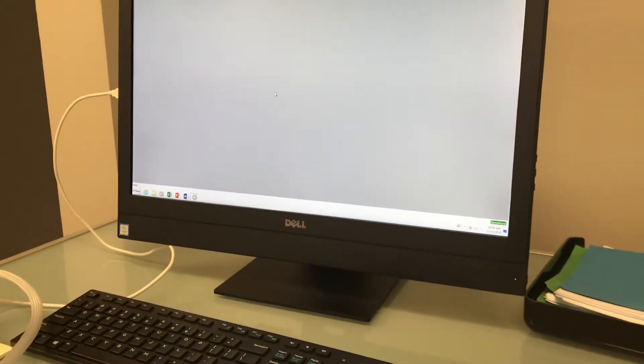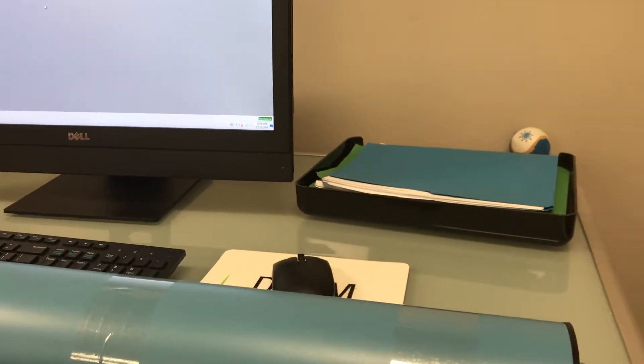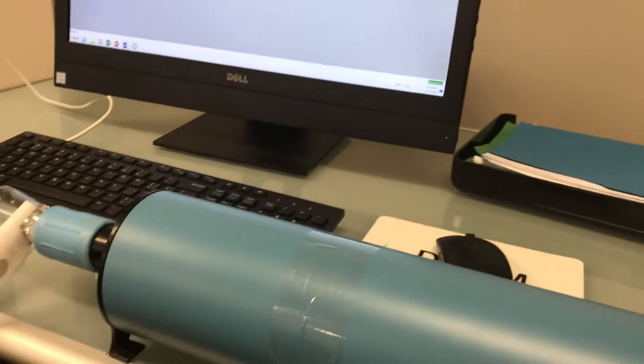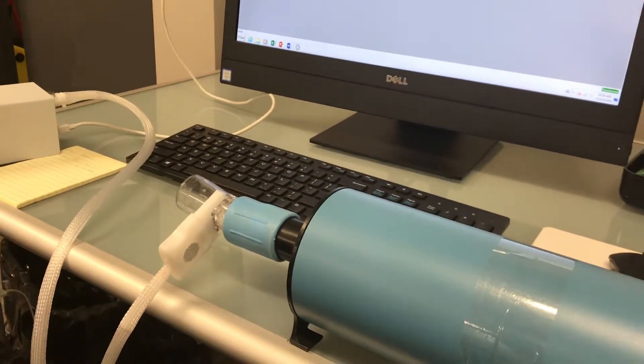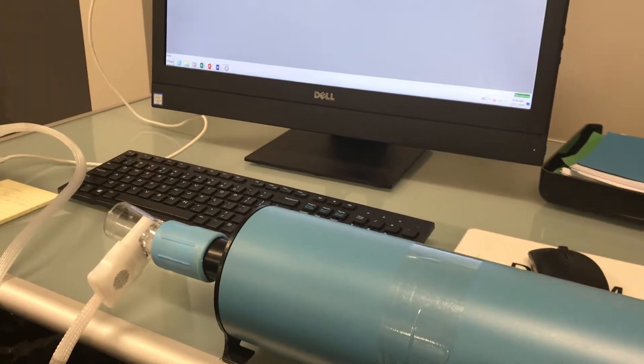Also, don't hit either end of the calibration syringe hard, making that clunking noise. That causes an artifact to be read through the flow sensor, and it doesn't matter what type or brand of flow sensor it is — that artifact will be read.